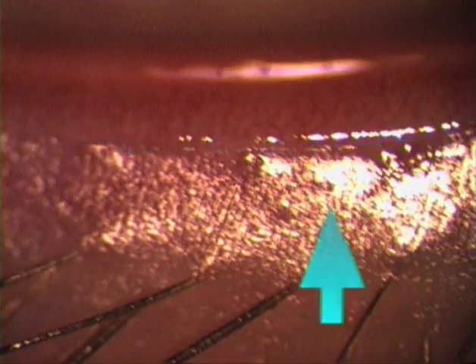Thus, in practice, looking for the delineation of the rugged reflex is the means by which the border between the cutaneous and the conjunctival part of the lid margin can be made out.